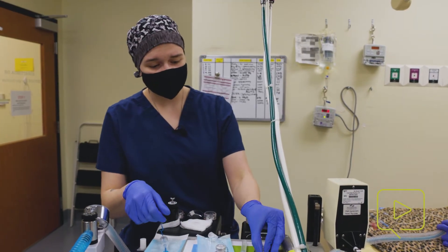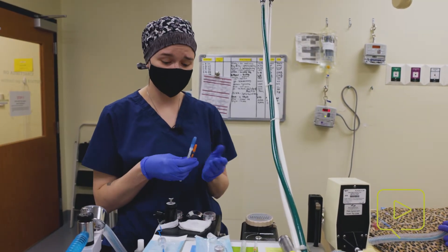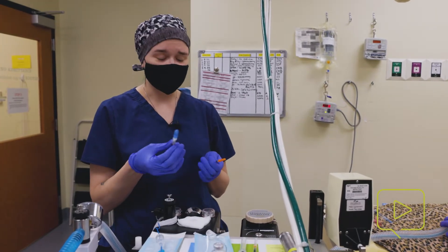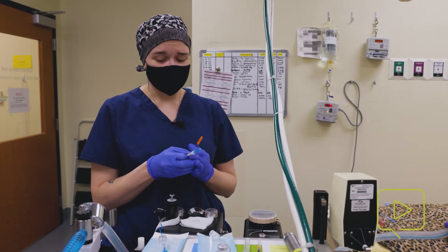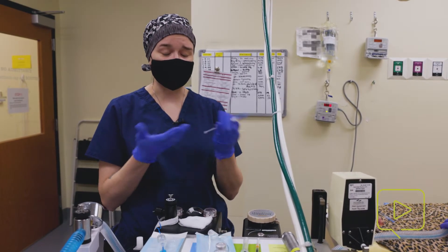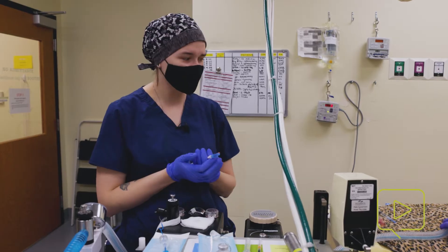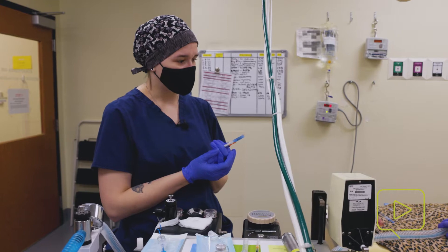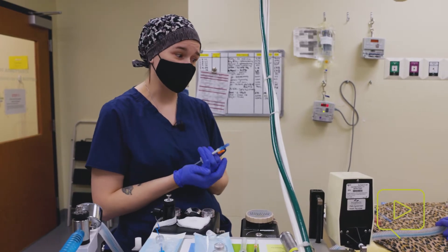We are going to go ahead and start induction. We are giving the remainder of his pre-meds and we're going to use propofol for his induction agent today. Propofol is a medication that you have to give slowly — if you give it too quickly, you can cause apnea, stopping them from breathing. So you just want to be conscientious of that, especially in a young cat. We don't want to create a lot of hypotension in these guys.